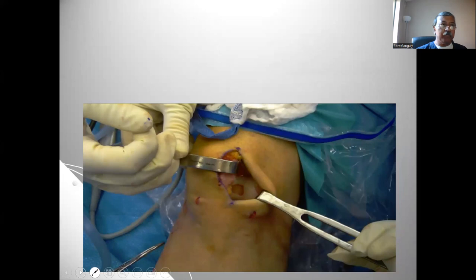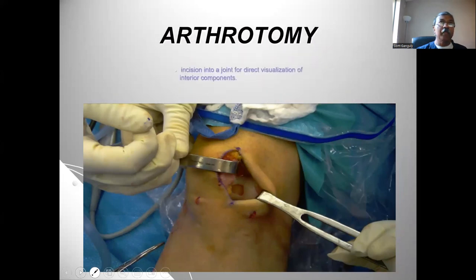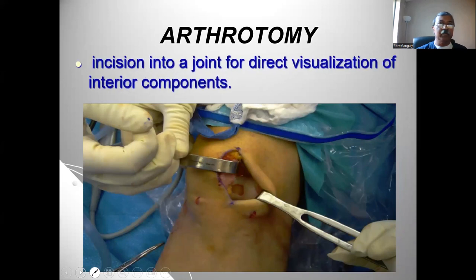Now, if you find that a surgeon is going to make an incision through the layers of tissue and open the joint, then we are doing arthrotomy. Arthrotomy is opening into, incision into a joint. Arthro refers to a joint. So arthrotomy is an incision into a joint. This type of surgery, as you can imagine, you need retractors. Army Navy here, and other retractors here.